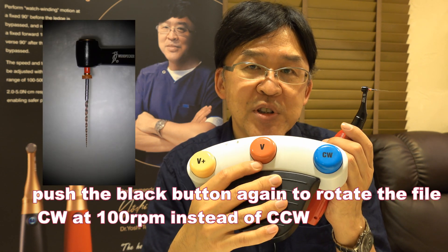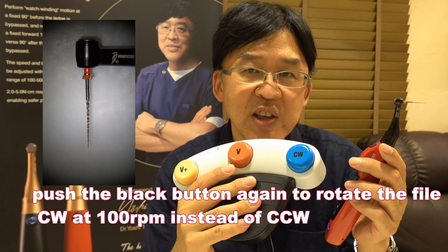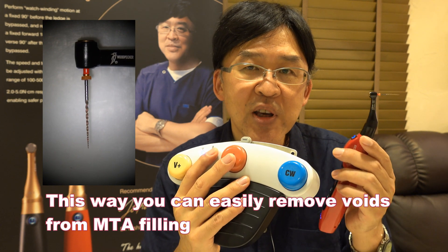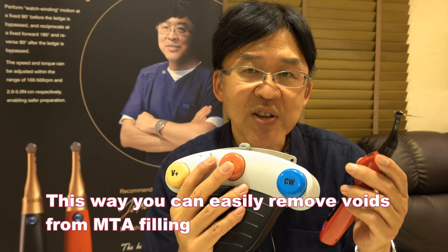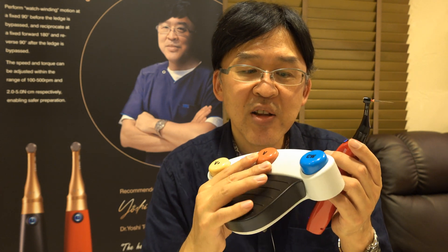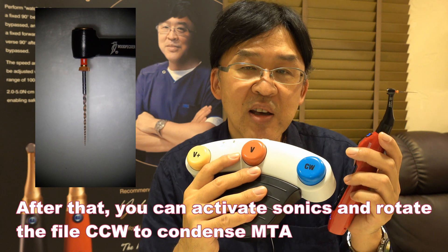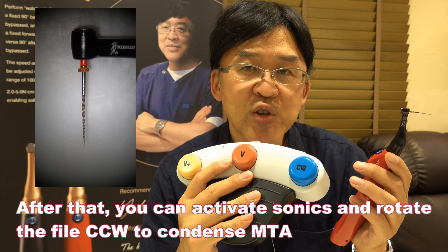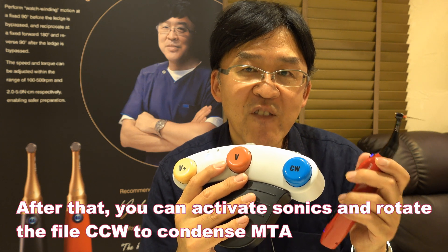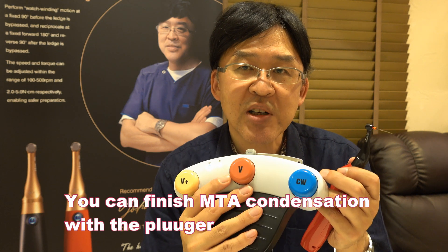You can push the black button again to rotate the file clockwise instead of counterclockwise. This way, you can easily remove voids and do it again. You can activate sonic again, then use counterclockwise rotation to condense MTA after you remove voids.